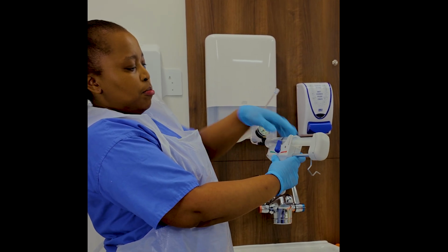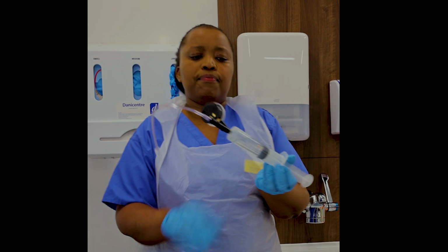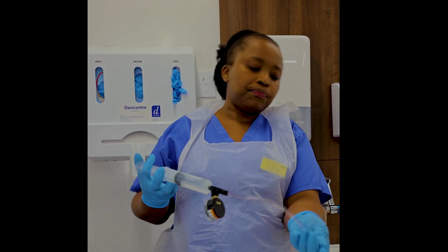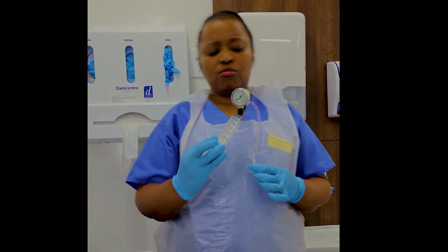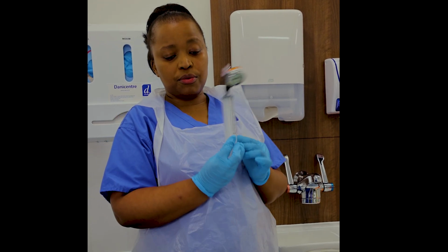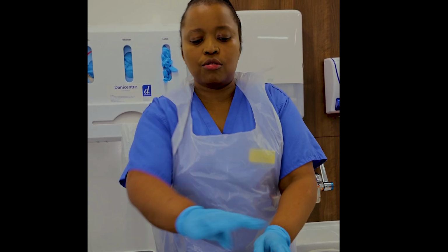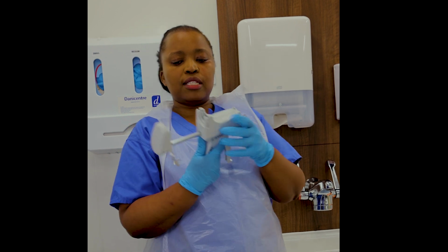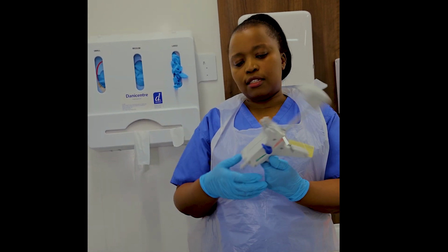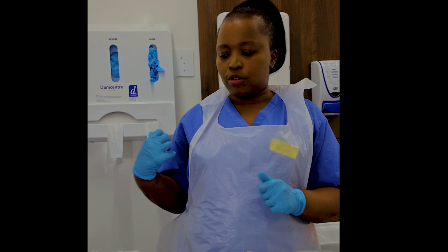Unlock is on neutral mode. Then we are in the position to remove our syringe. Then we will deflate. This syringe is just single use, so remember we'll throw that, we can never use it again. The balloon is also to throw. It's just according to your guidelines on how we throw the balloon away. Remember again, we need to reuse the gun. So we need to clean, disinfect it with the wipes. Keep it safe for next time when we need to use, so that you don't have to worry that it's lost.